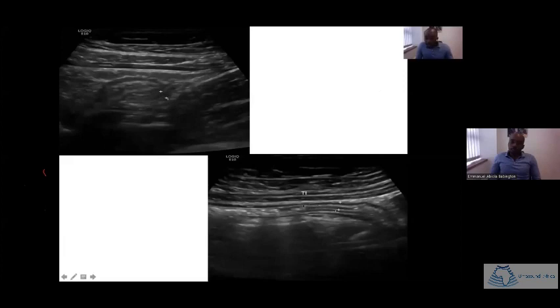So here we have a terminal ileum. You can see it continuing from the distal ileum there and opening into the cecum. There is a bit of gas and chyme in the distal end of the terminal ileum going into the ileocecal valve. We couldn't even make out the ileocecal valve. So this is the terminal ileum there, and you can see the wall stratification, the individual layers of the bowel. You can see the caliper placement of the measurement there. We tend to shorten terminal ileum as TI.